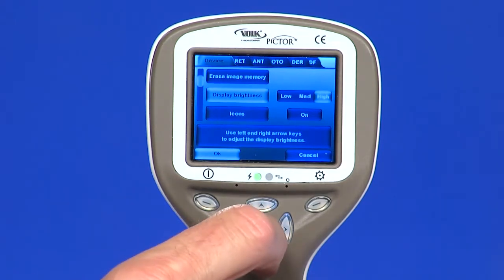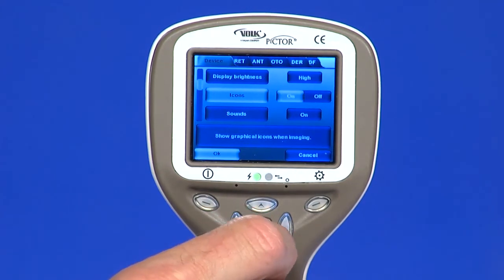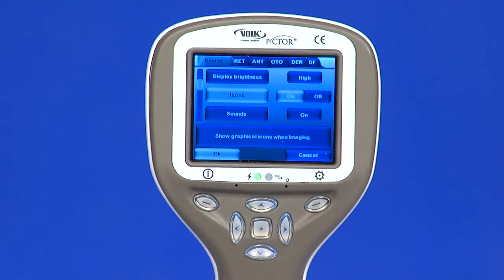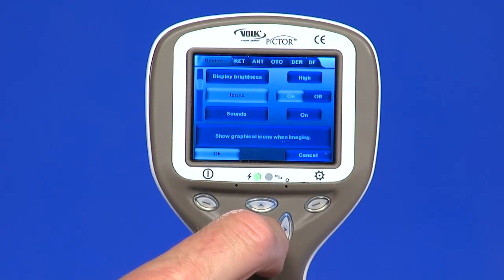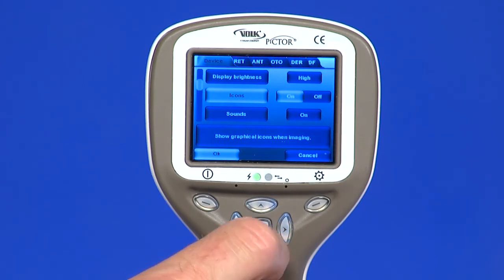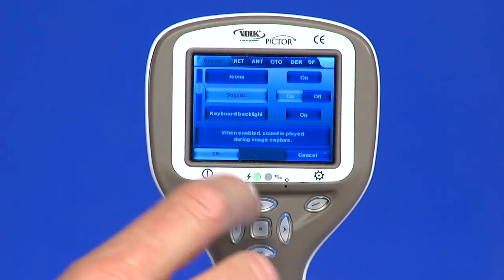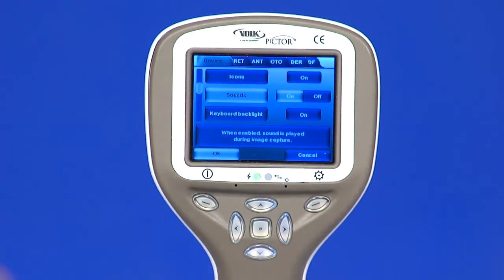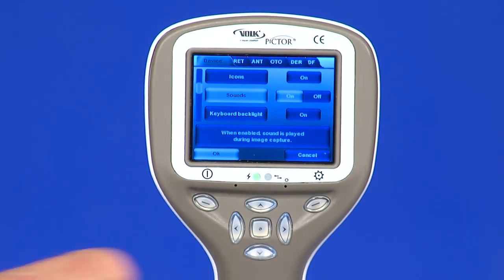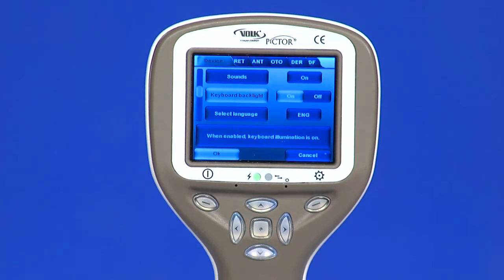Icons: the icons shown on the camera screen can be enabled or disabled to the user's liking. The most essential icons such as the menu icon are always visible. Sounds: by default, the camera makes a sound during image capture. This sound can be turned off from the device menu.